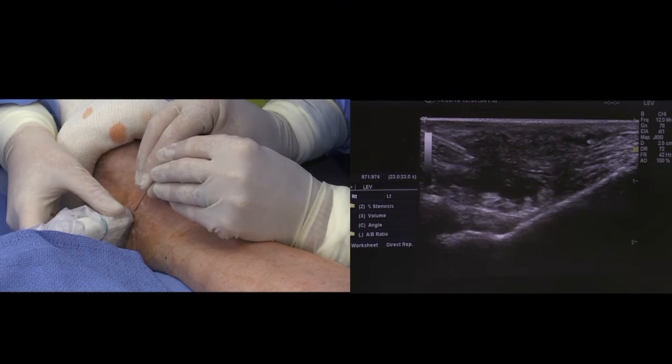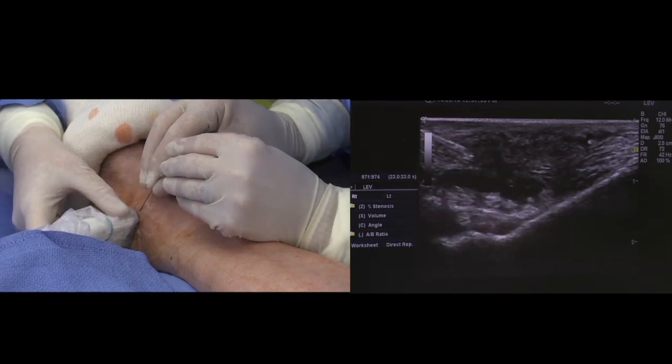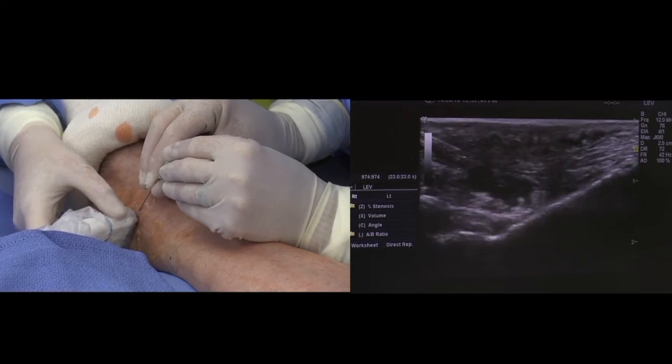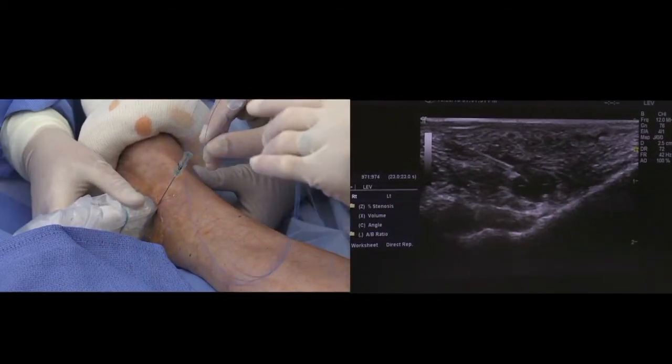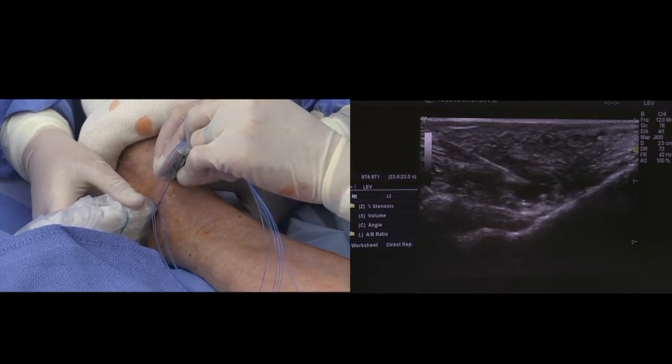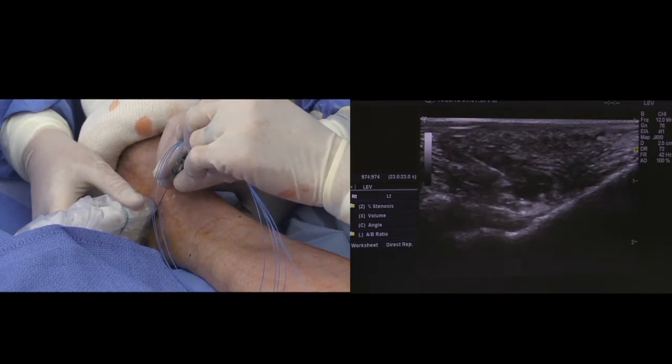And when we get close, try to reposition the ultrasound so we can see the perforator exactly where our point is. Put the laser in — you can actually visualize it hitting the vein wall.